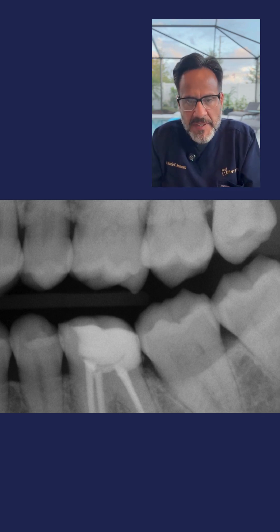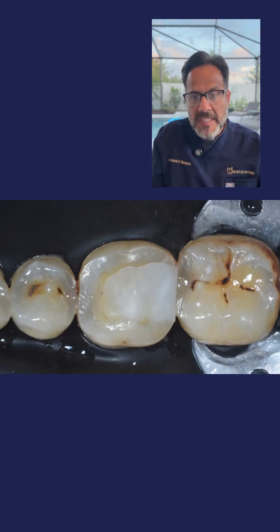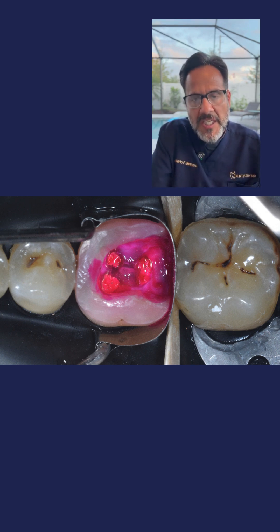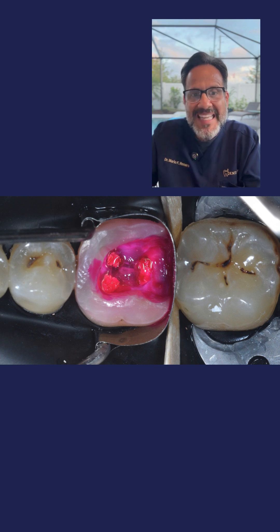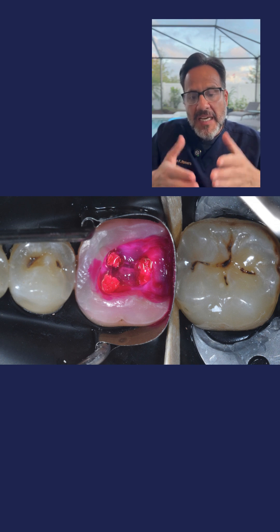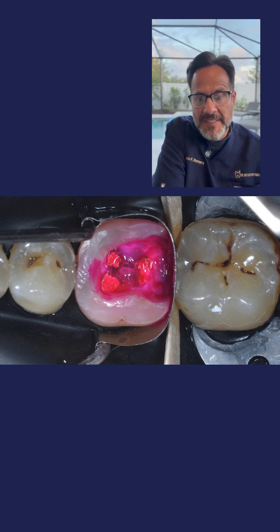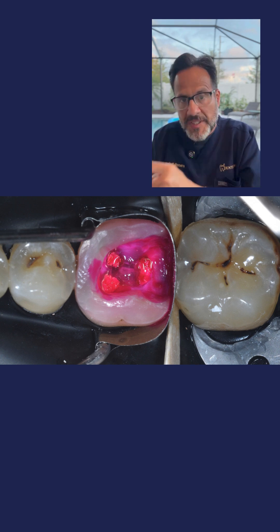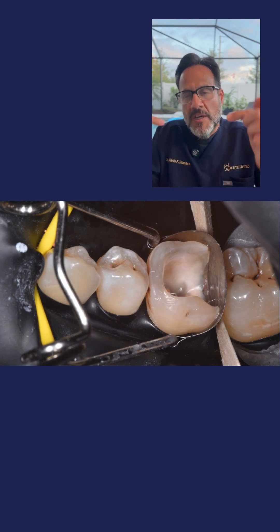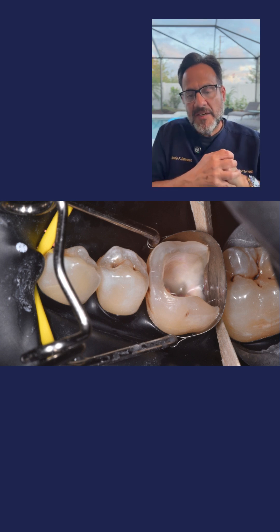Here are the steps needed. Step number one, shown in photo number three: rubber dam isolation — this is critical. Step number two: once you have rubber dam isolation, you remove the existing restoration. You then eliminate all the caries within that margin, making sure you have a clean peripheral seal zone, using a caries detection dye. Then, to restore the tooth, I use saddle matrices, which are super helpful for these deep margins. As you're seeing here, I have already placed that saddle matrix.